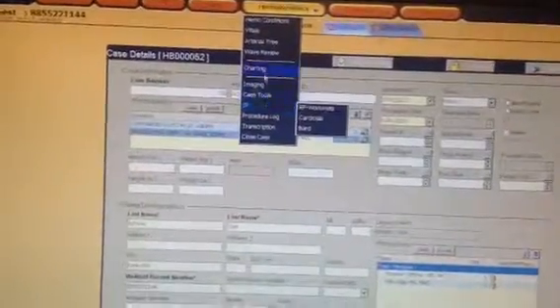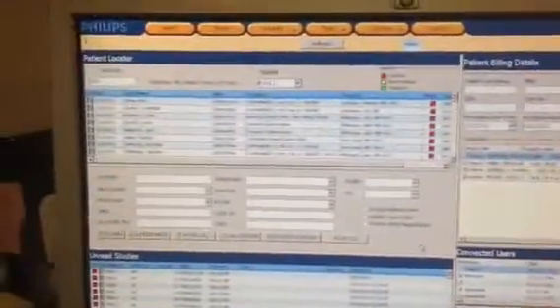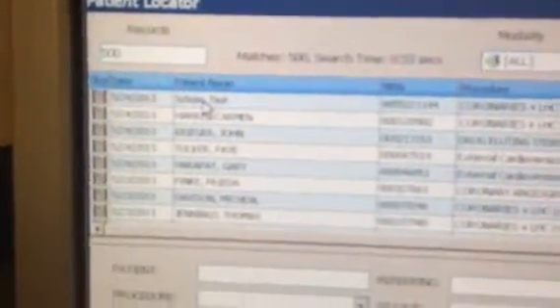After that, the recorder can continue to record Dr. Lee's case as he or she normally would. And Dr. Schomer can come over to the computer that's to the left in Lab 2 and to the right in Lab 3. Select the correct patient, which would be in this case Test Schomer. That brings up that person.